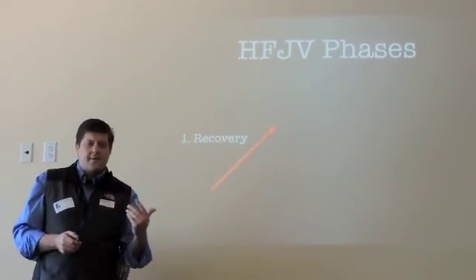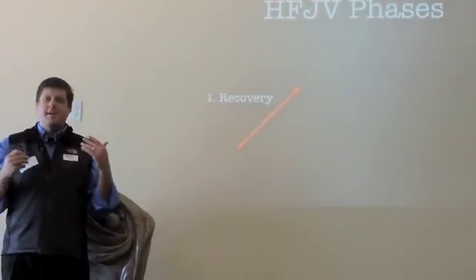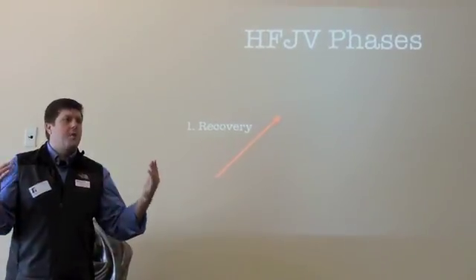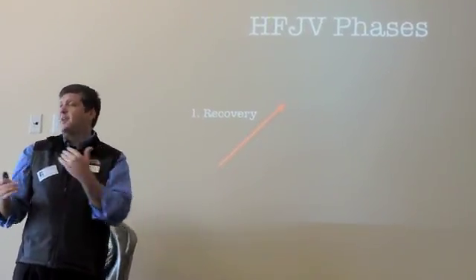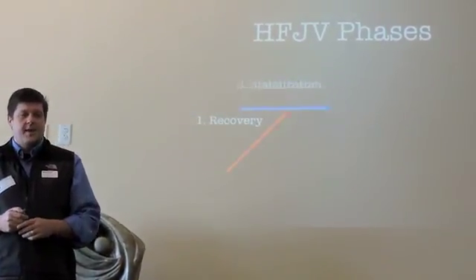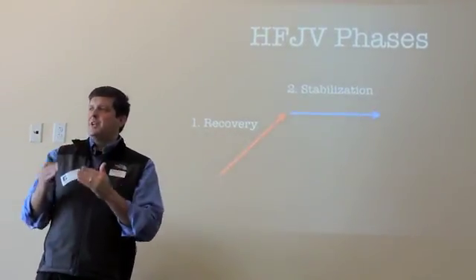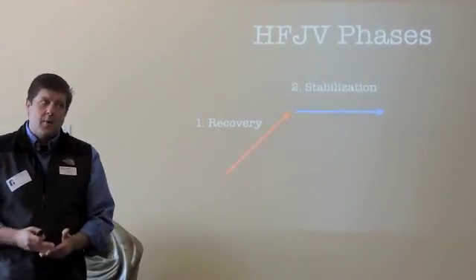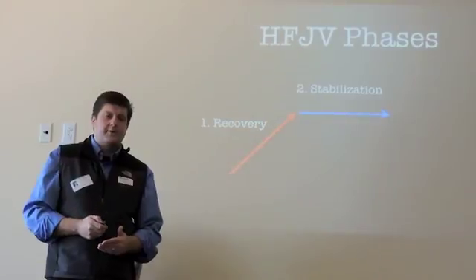But we often come across these phases. We have this recovery phase where a kid's not doing so well, we throw them on the jet, it's a rescue mode, we use crazy pressures and crazy strategies, finally we rescue the kid, and we've gotten really good at doing this over the years. And then there's a stabilization phase where you have to chill out. You have to let the baby grow. You have to let the airway inflammation die down a little bit and the chronic process die down.